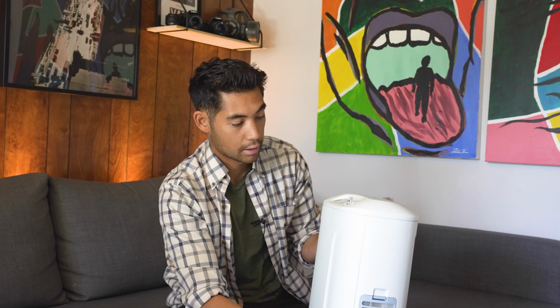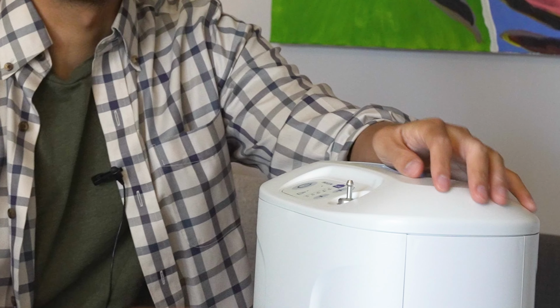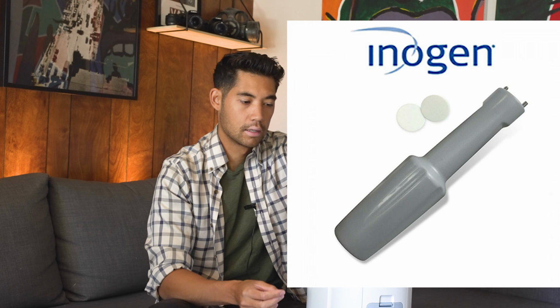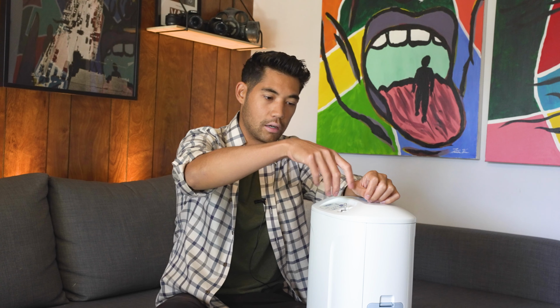The last filter is your output filter. So that's right behind the barb. You'll need a special tool or a little spanner from Inogen, or you can probably find an off-brand one, but if you want to use the Inogen one, you grab it, it comes with the filters and you just spin it off, you take the barb off, then you can use some tweezers to take out that little filter. It's a little tiny circular filter, and with that filter, you're going to want to replace that once a year, or if you change patients with this machine.